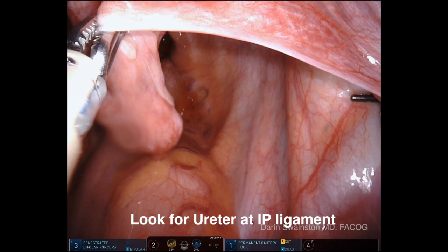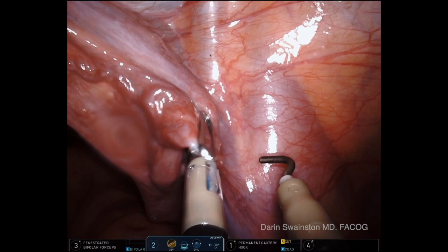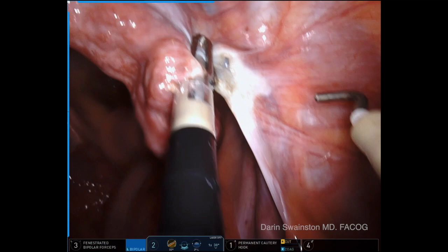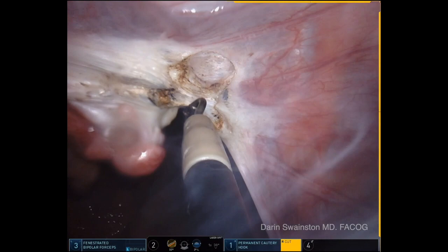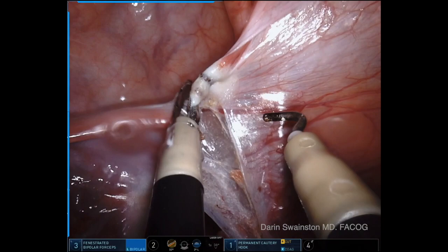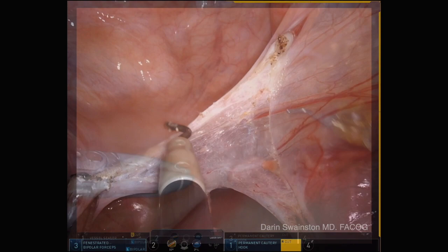This is the XI single-site platform. I want to make sure that as I take this infundibular pelvic ligament, I am being careful not to injure that ureter. I'm going to use these bipolar fenestrated forceps to cauterize, pull up, and create a lot of traction, trying to leave behind a minimal amount of thermal artifact. See that one-third/two-third technique? We take the round ligament the same way — leave behind one-third and take the two-thirds attached to the uterus.